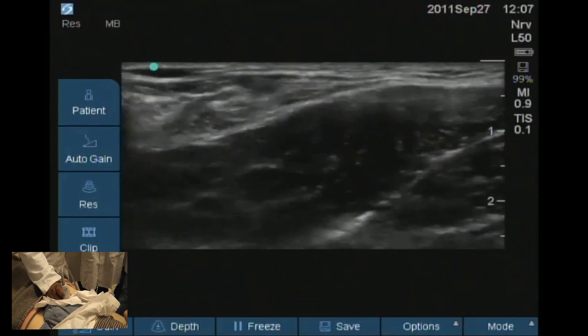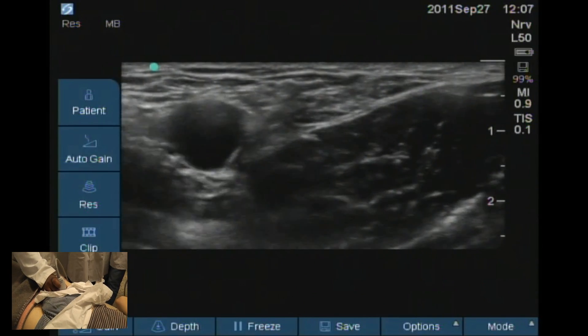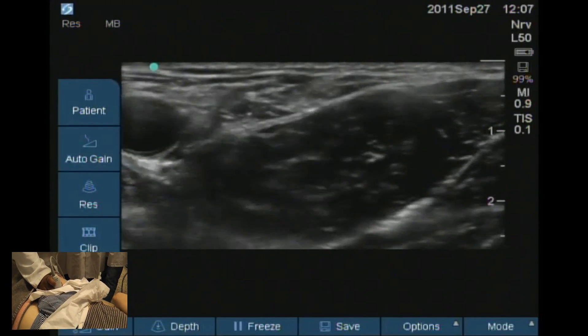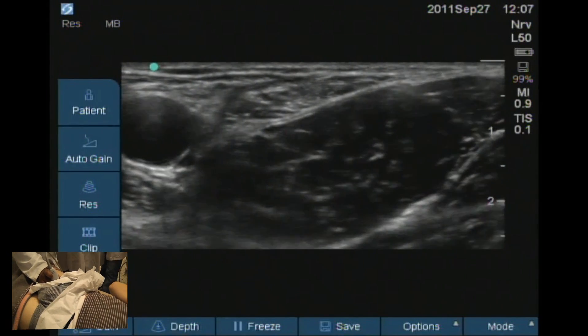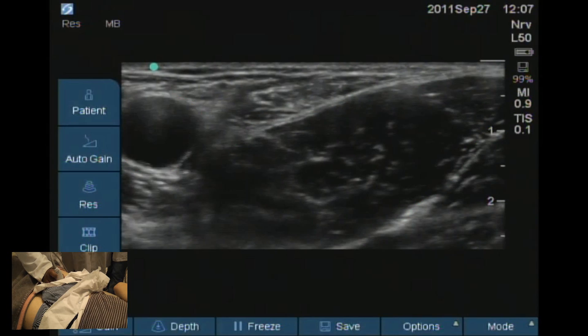There is an obturator nerve which we can do sometimes. If you want complete pain relief with the peripheral nerve blocks alone, the way we do it is trace on the medial side of the femoral artery and we look for the pectineus muscle, which is at the base of the femoral artery.